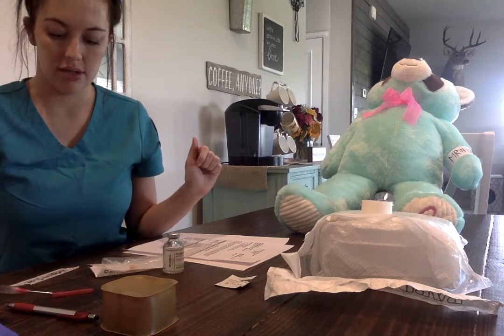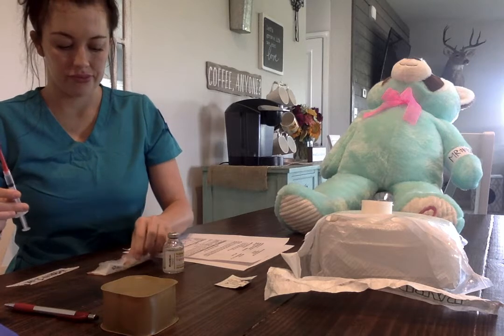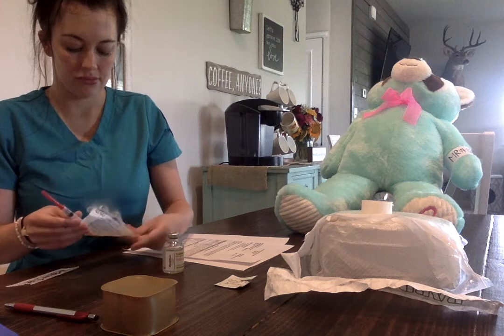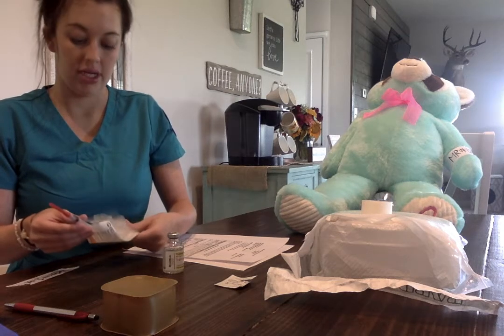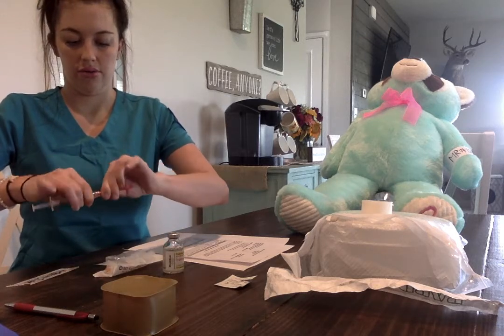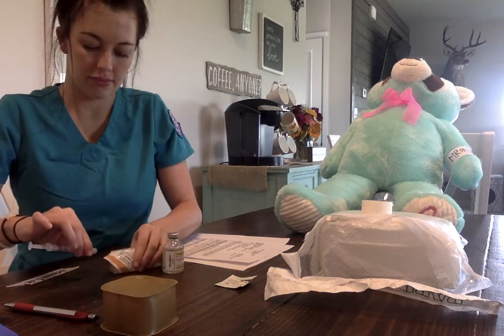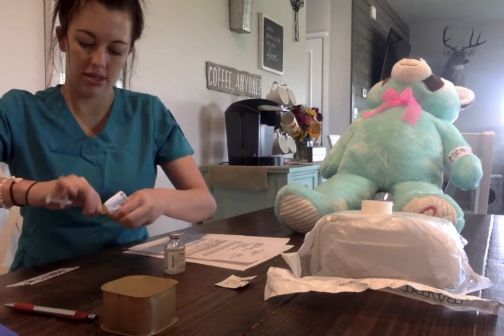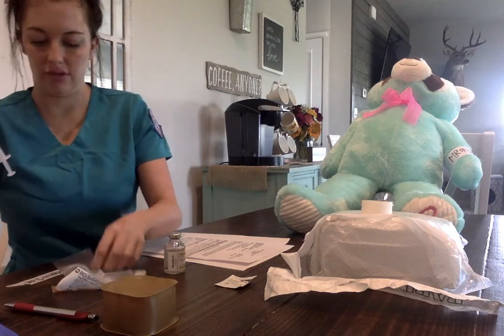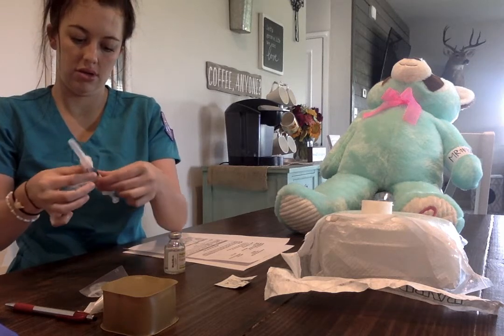Okay, I'm just going to go ahead and recap that blunt tip. Get this out. There we go. And get rid of that. Label.